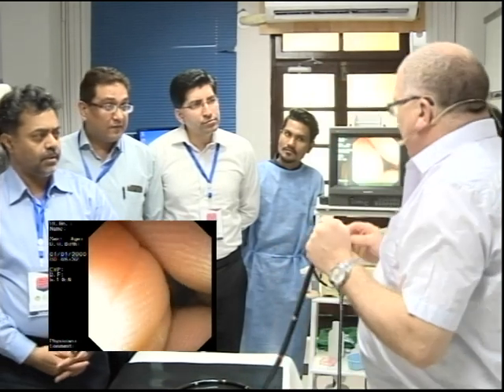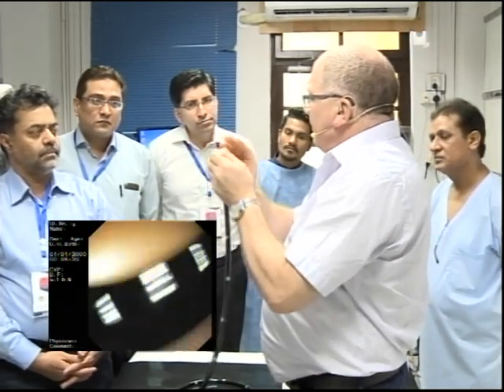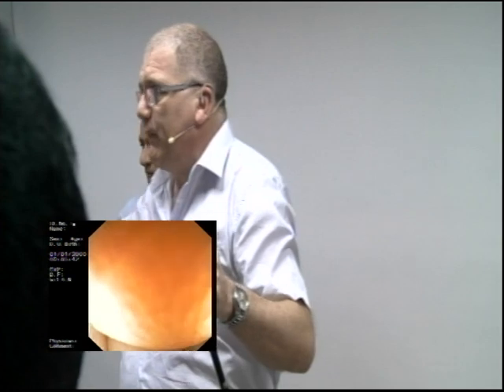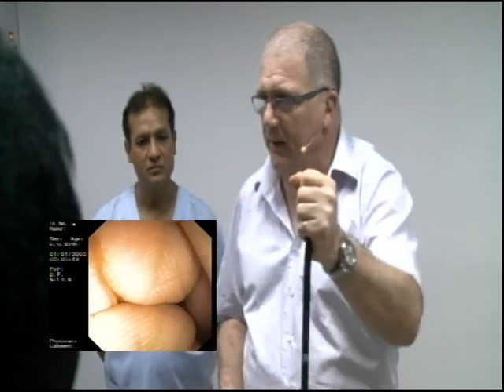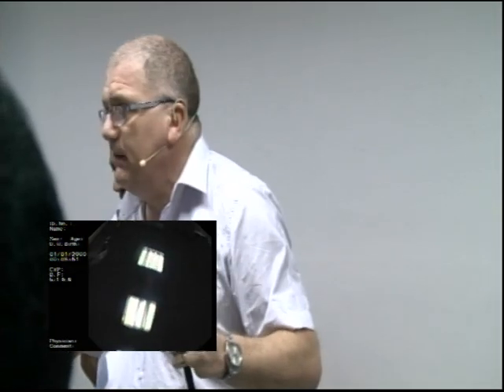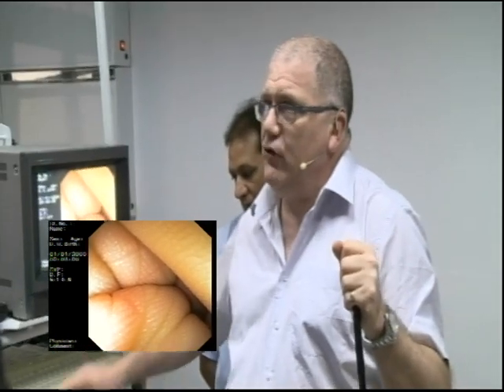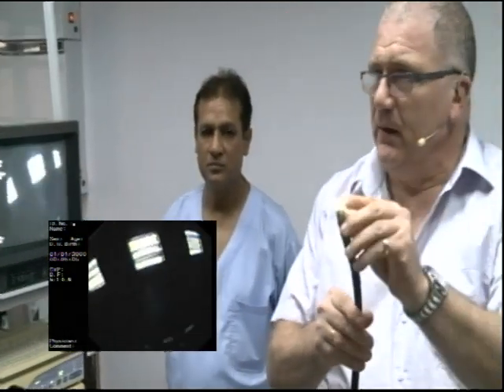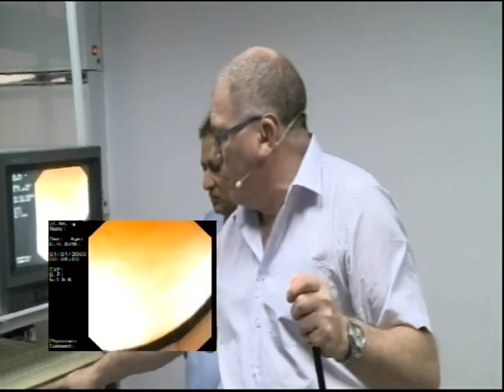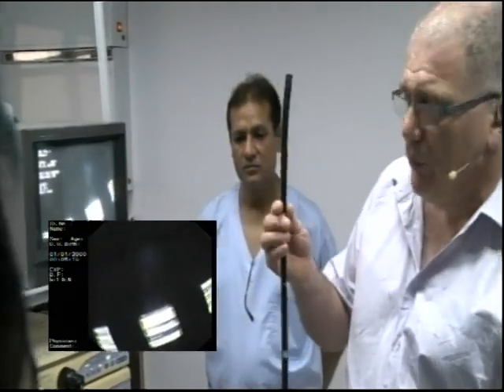No. What it's doing is that it's flashing the three primary colours. And the chip on the end perceives what is being reflected and gives you a perception of colour. So the most important thing when you're ever colonoscoping or gastroscoping or doing any ERCP is to tell this, through this, what white light looks like. So that gives it a foundation. It flashes so that it will measure the light that's reflected back, and that'll give you a perception of colour. On the older system, it's a solid light, so it gives you what it thinks is, again, a perception of colour. But strobing is very important.